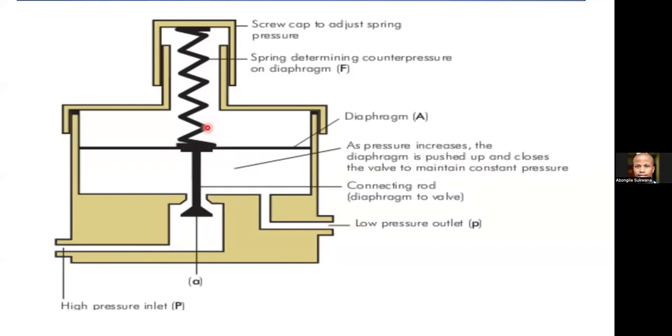You've got a force applied here, you've got a force applied here, and then you reduce that pressure that was coming here via this to a low pressure of about 4 bar, which is usually constant. So just remember that there are two forces happening at the same time to try and reduce the pressure such that you get a low pressure system.